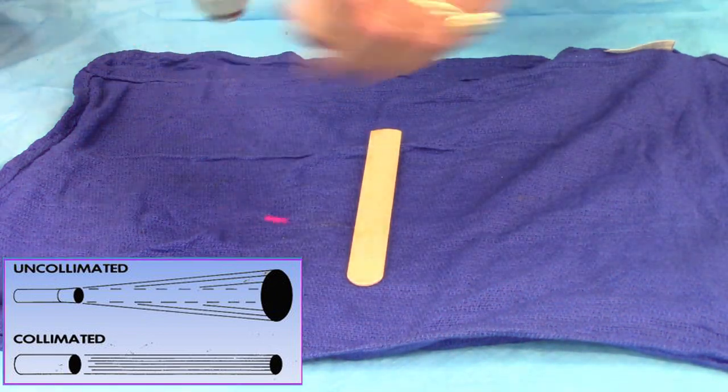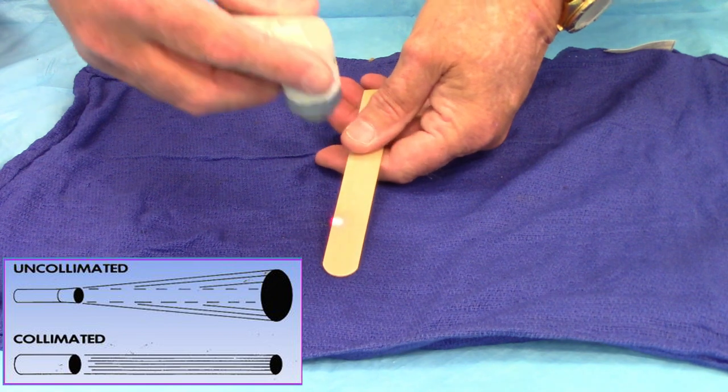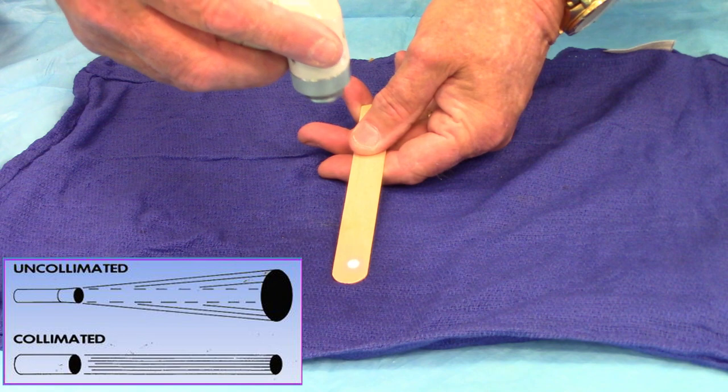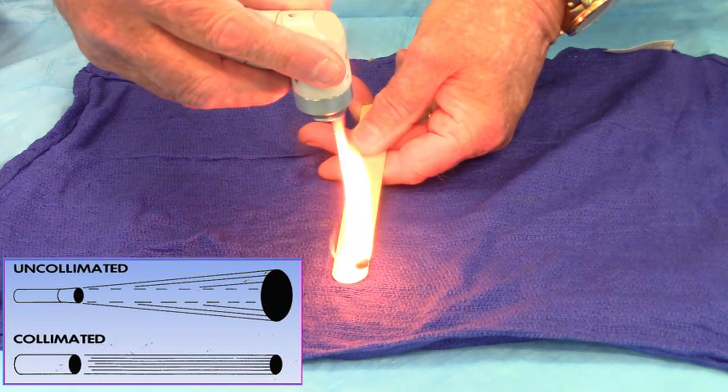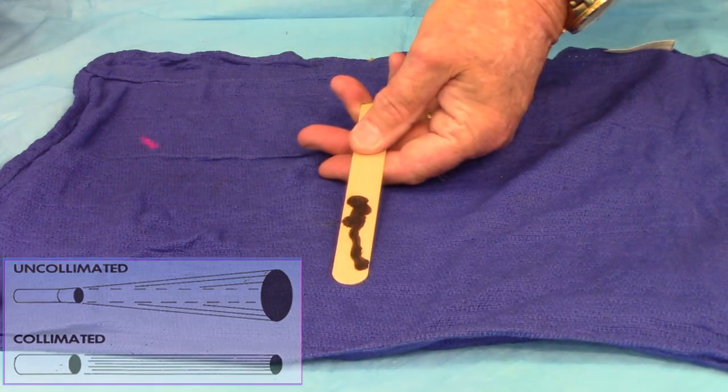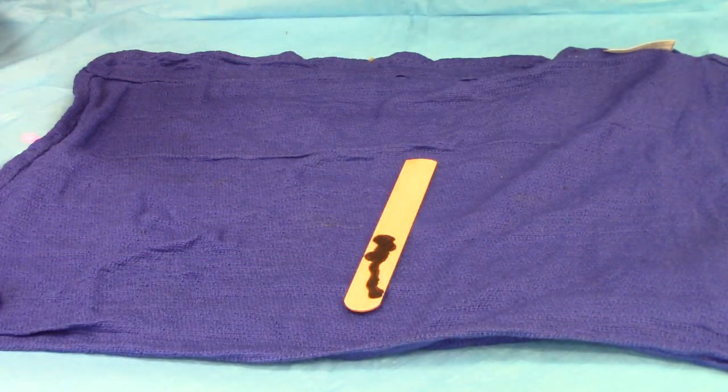Now I have a collimated beam. There is no focus or defocus — it'll stay the same size regardless of where I am. So at this distance it flames, but the farther back I go, it does the same thing. It holds the same size at any distance.